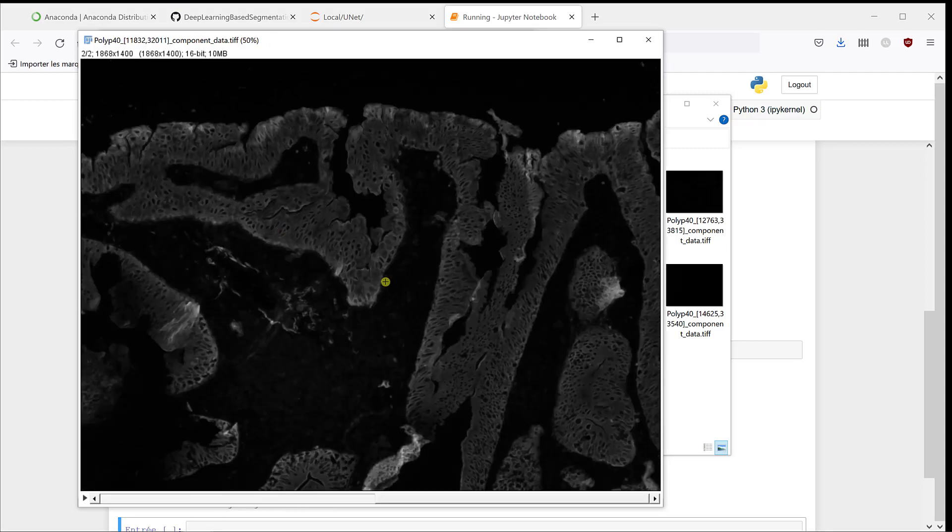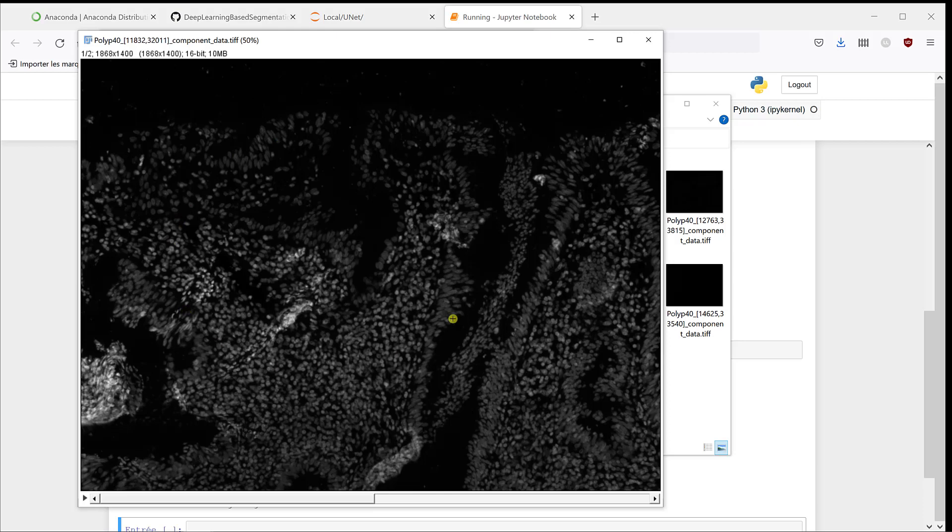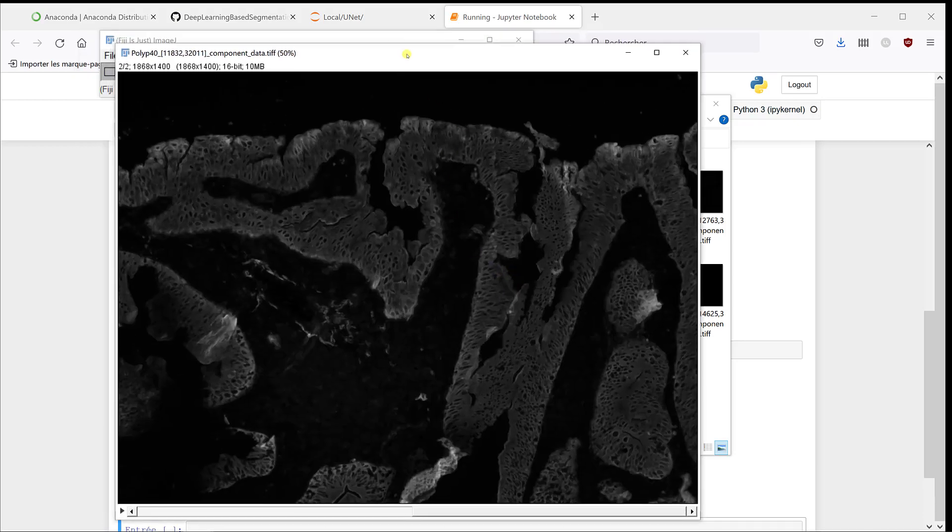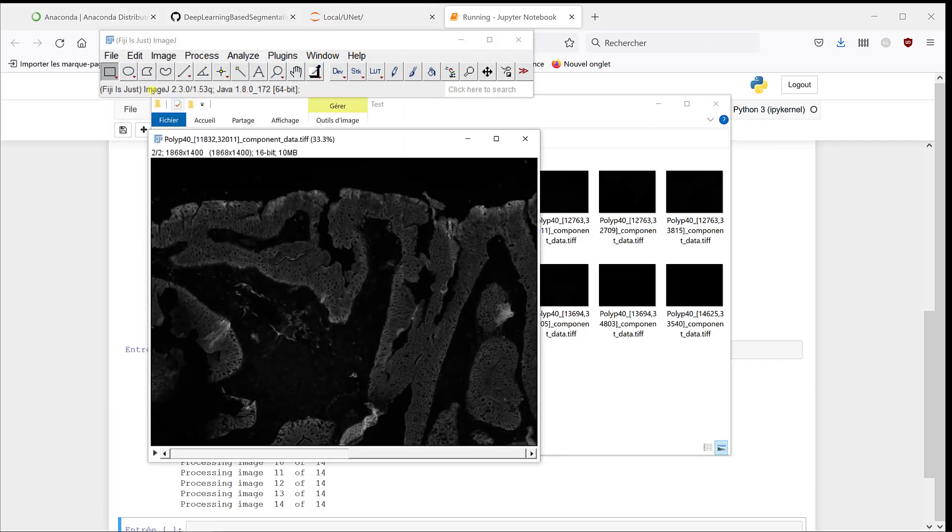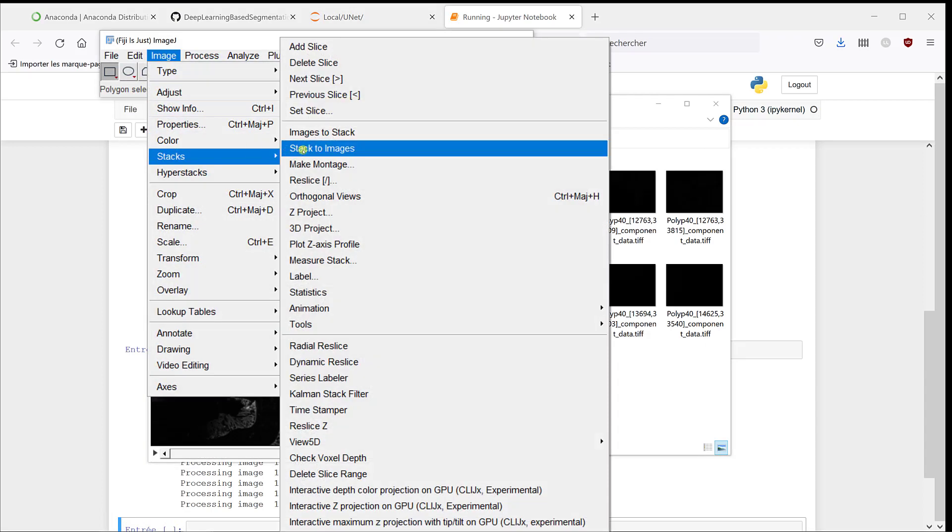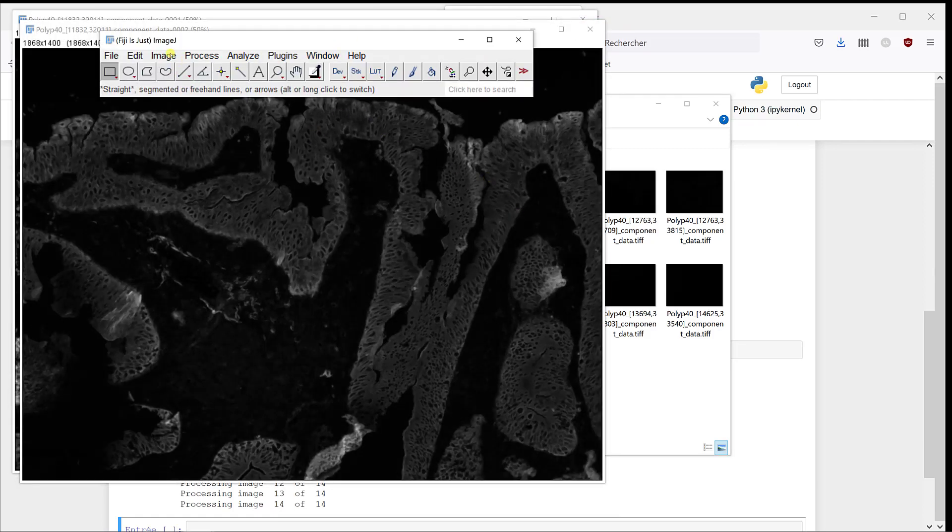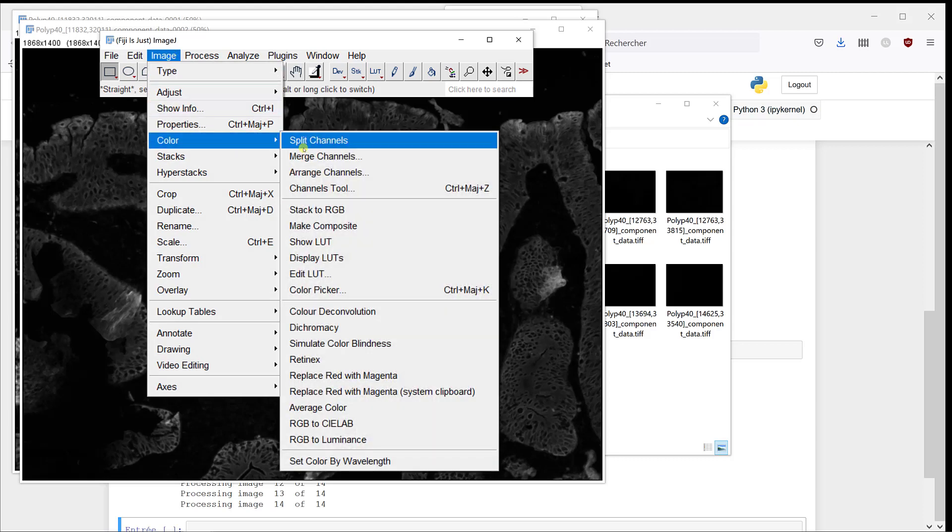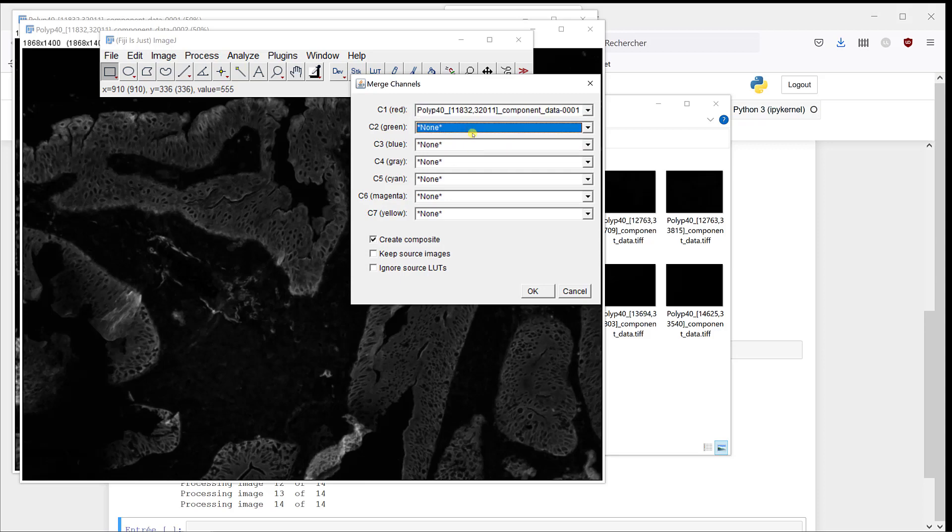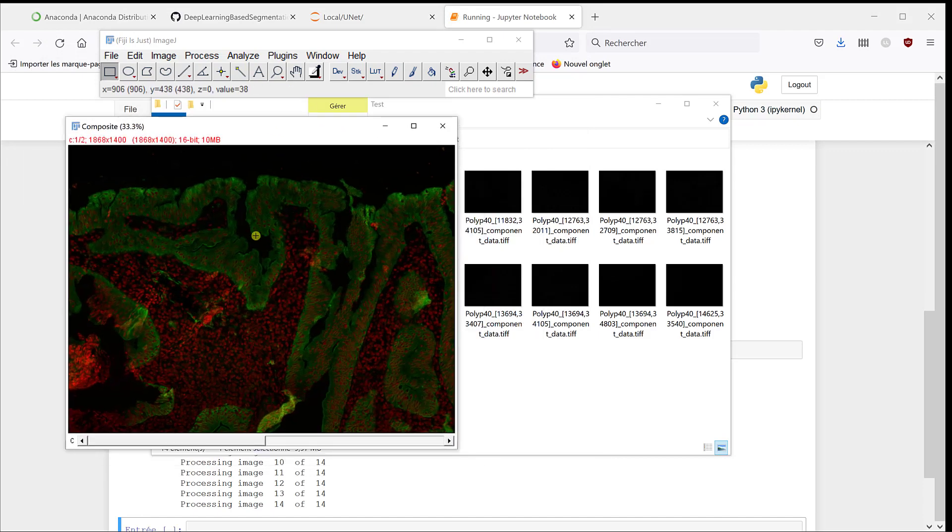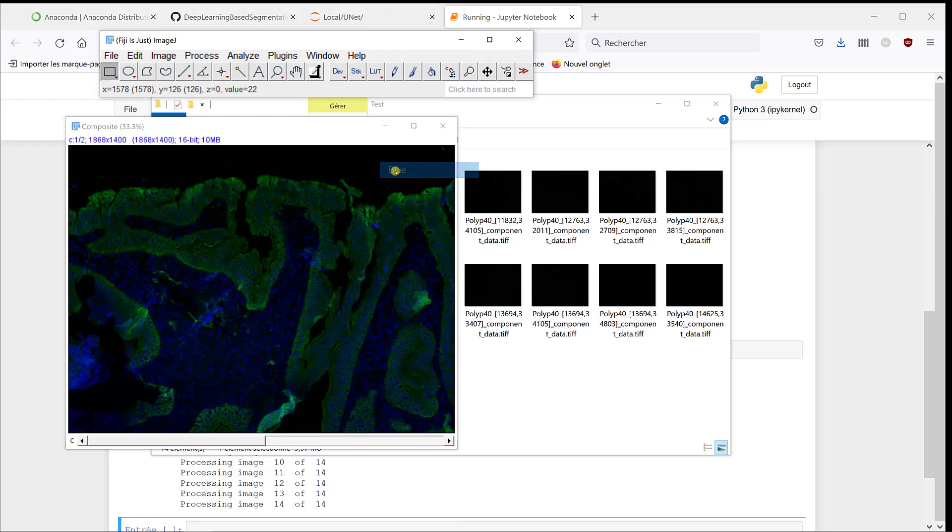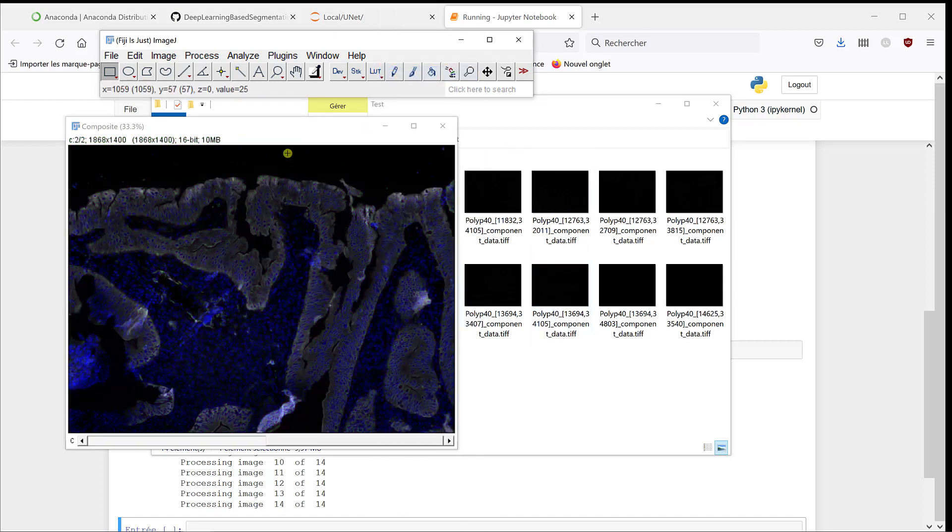So here, it's all the stacks. The first one corresponds to the DAPI, and this corresponds to the Cytokeratin. So maybe to have something that's easier to visualize, I'm going to do a stack to images. I'm going to merge channels, and I'm going to take four stacks. So we can have a look at both. If we want to have the same colors as before, it should be in blue for DAPI and in cyan.